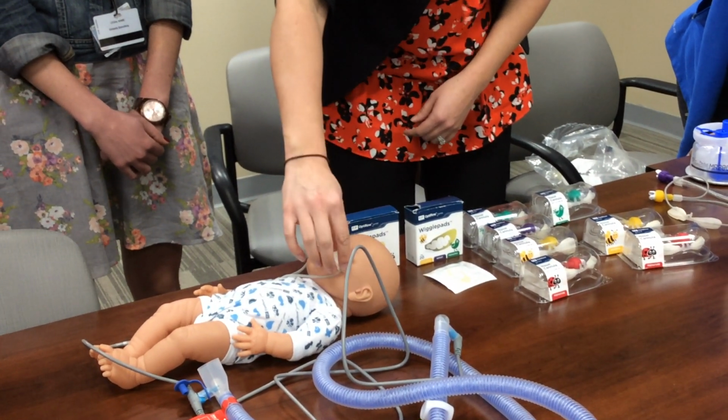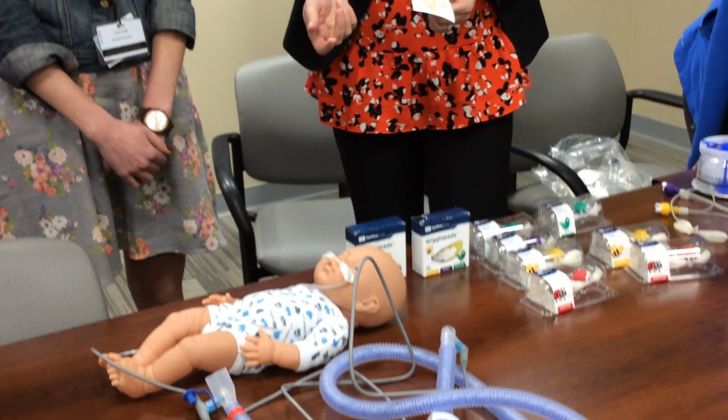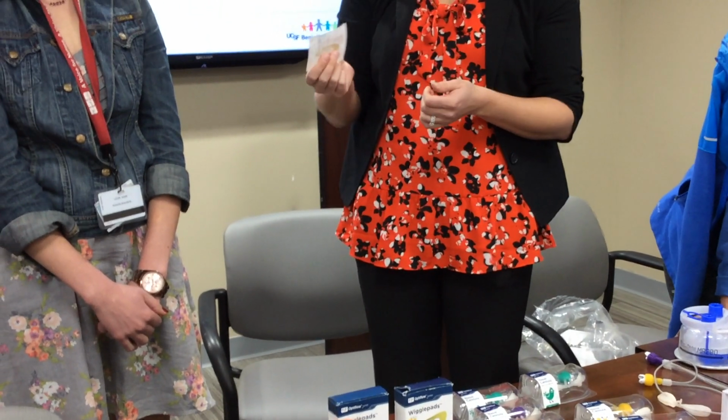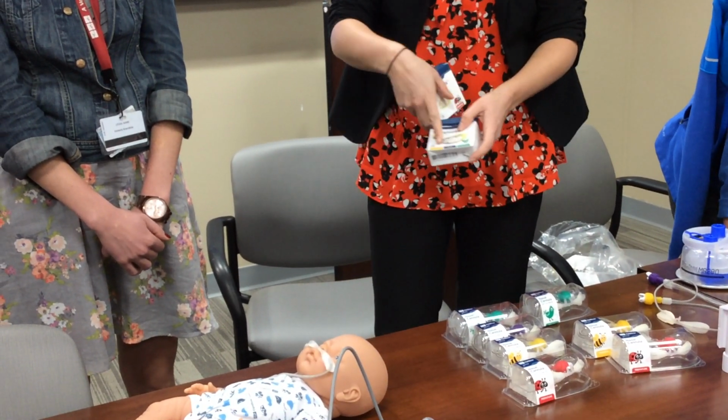The wiggle pads are designed to last 7 days, but if they get creased or soiled or anything and you need to replace them, we do have extras, and they match the colors of the cannulas.